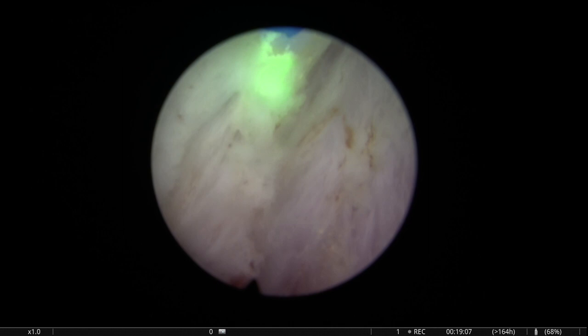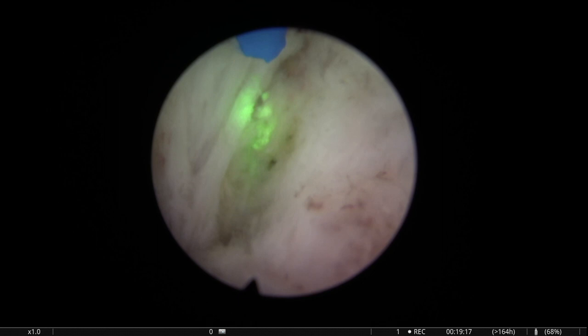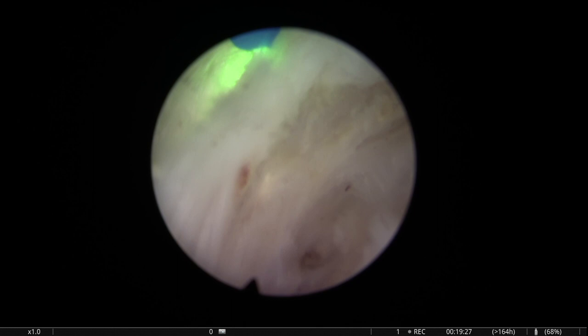Sometimes this attitude gives you, let's say, several possible planes, and maybe you will see that we will leave a piece of tissue there and that we will remove at the end. But as I said, I think it pays off to be thorough, to be good at removing the whole amount of tissue.